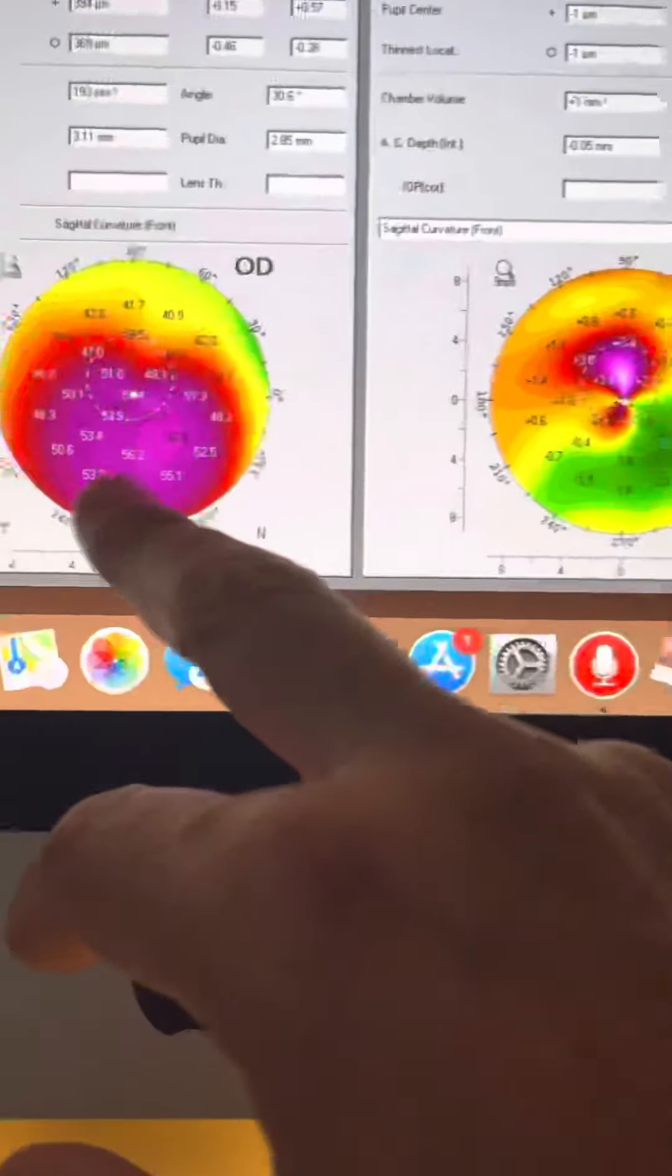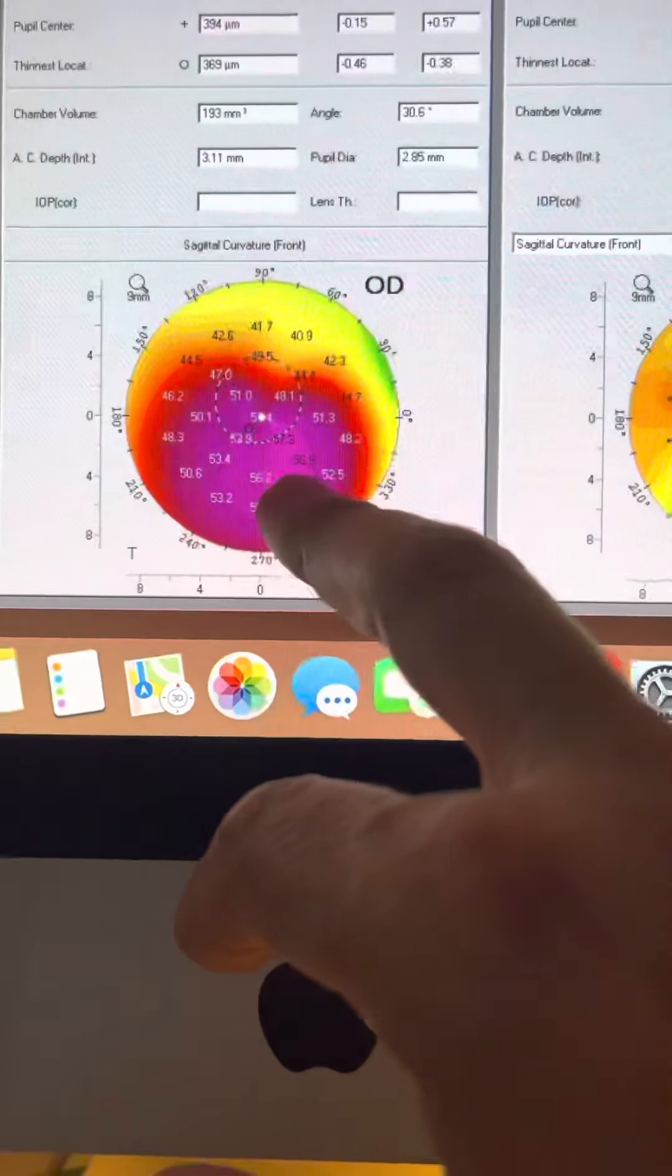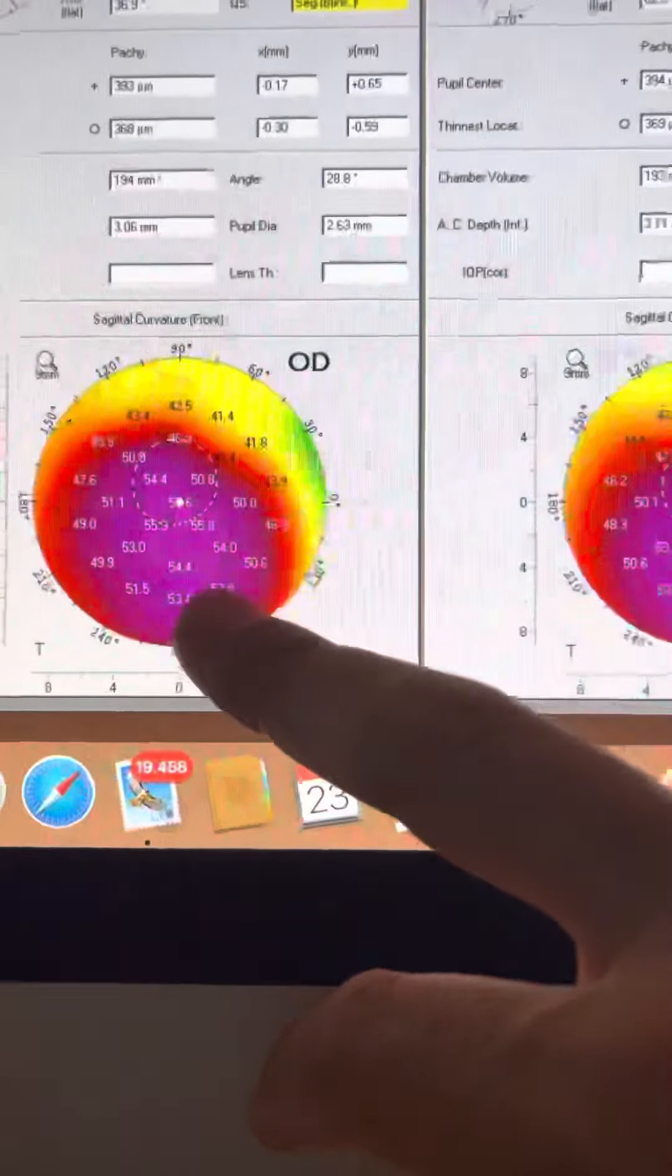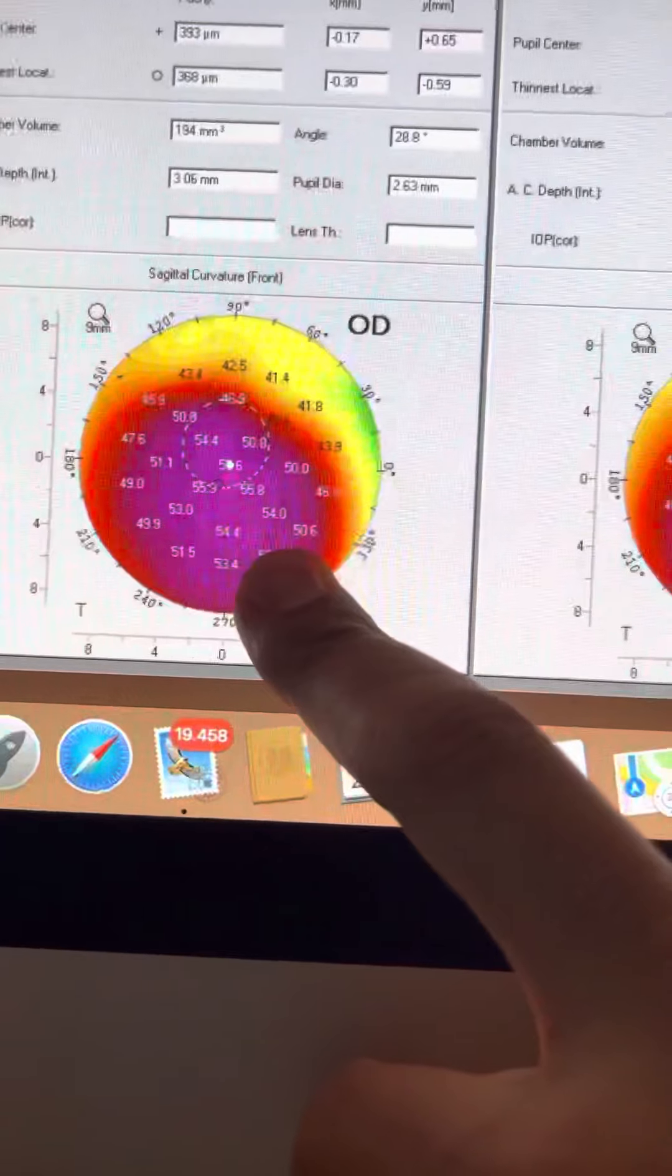So this is the patient image today with steepest cornea close to 57. And this is last year with steepest cornea at 54.